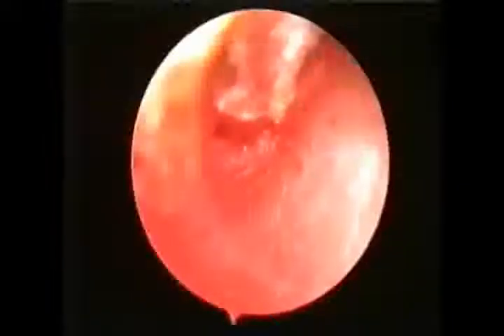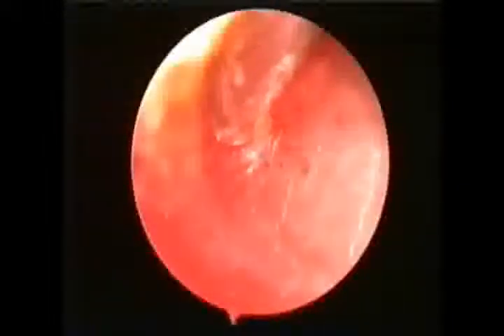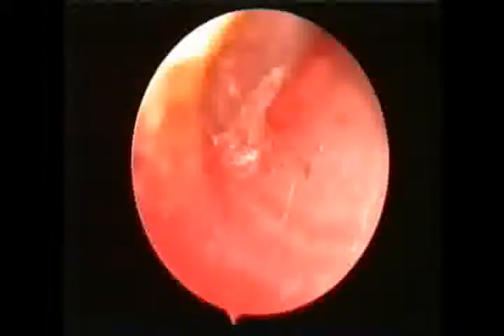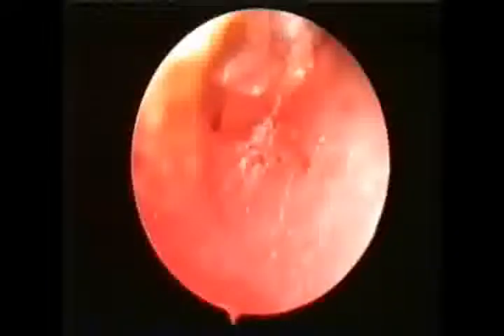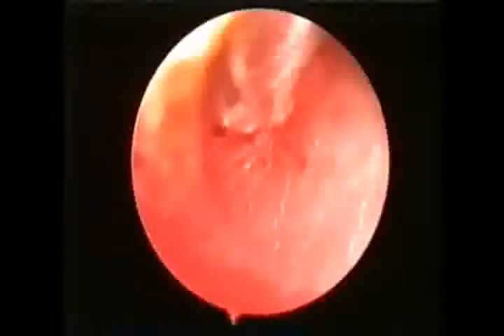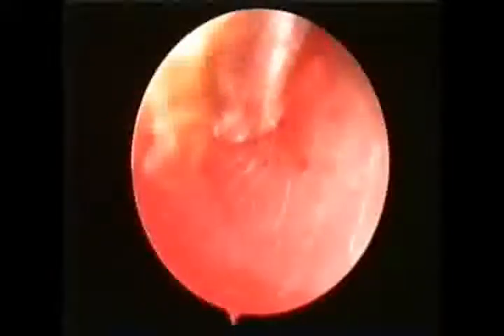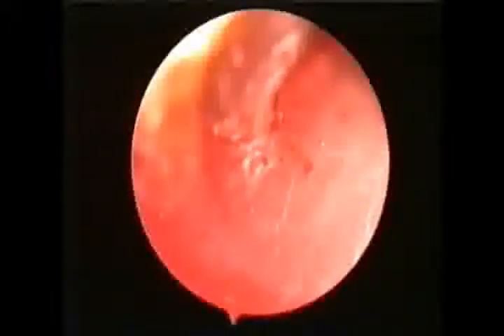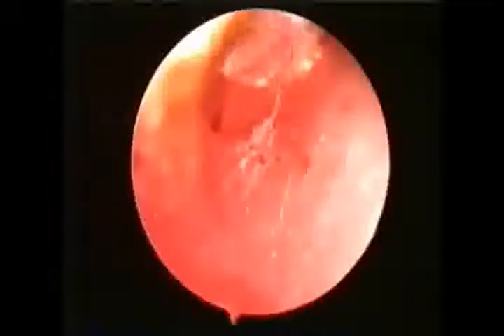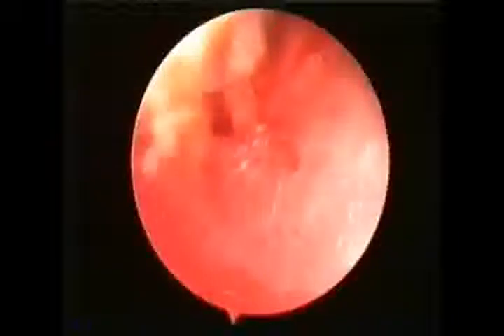Here you can see the glue emerging through the incision, and you can also see the fluid moving in the middle ear through the tympanic membrane. We continue suctioning of fluid till most or all of the fluid is cleared from the middle ear.